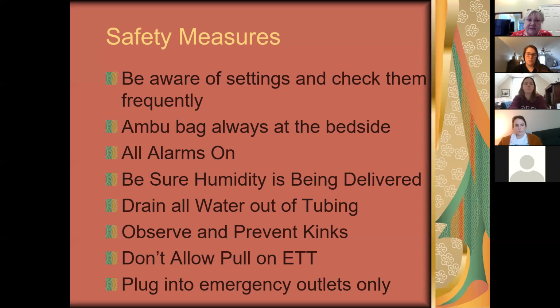If your patient is unstable because they're alarming, then take them off and bag them until respiratory gets there. If they keep alarming but it doesn't seem like there's anything wrong, then leave them on there. But like their PO2s are good, their SaO2s are good, everything seems to be fine, then leave them on there. But if it's a high pressure alarm, then go over and suction them.